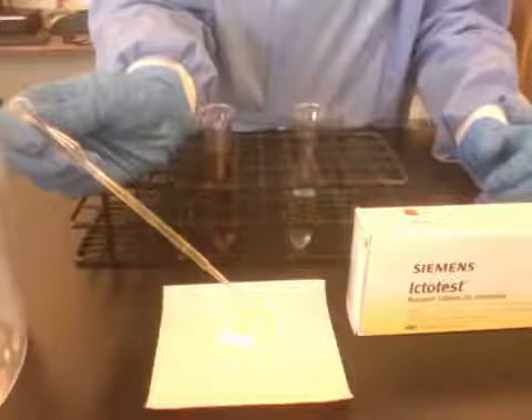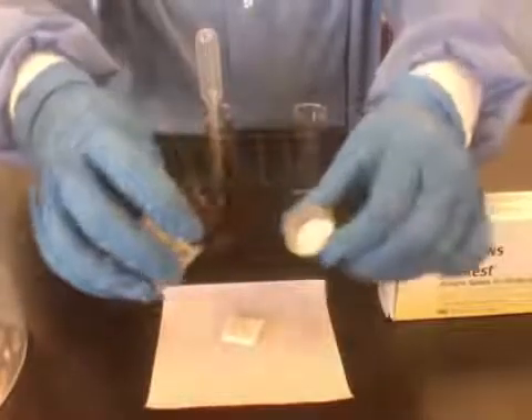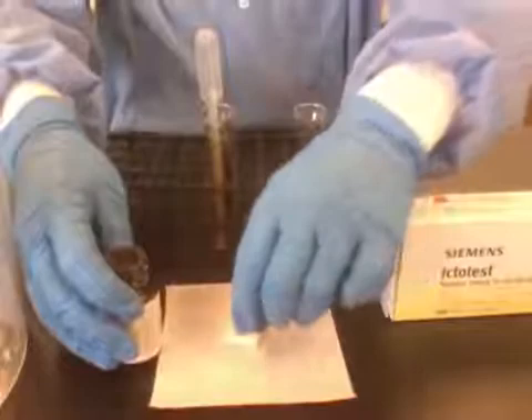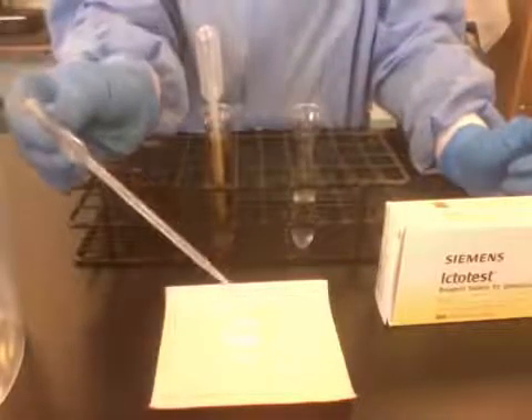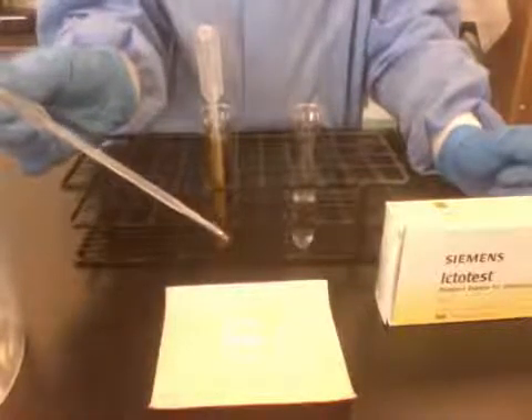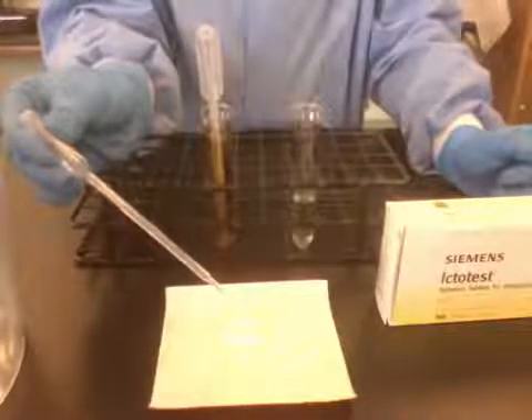One, two, three. Then you're going to add the Ictotest tablet. I'm going to shake the tablet off into the lid first, not onto my gloves. You should not touch these tablets. And then I'm going to gently, carefully place the tablet onto the pad. Replace the top of the vial. Now we are going to add one drop of water to the tablet, and then one more drop and let the color run over.